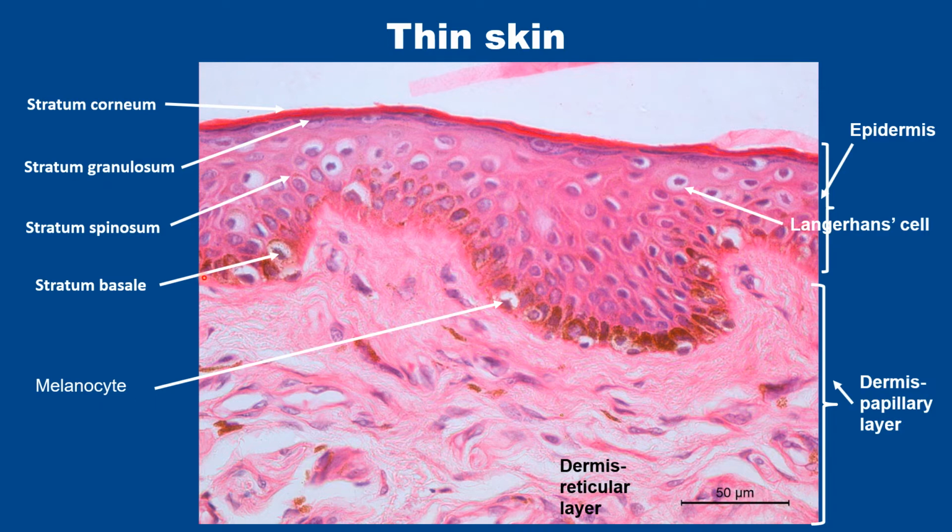Now stratum basal, there are lots of cells with pigments. Here the melanocytes can be seen. There is a cell here with some spaces around it. Here also another one. There is another one. This is another one. One can see some of the dendritic processes also coming out, and the other cells which are visible are the stratum basal cells, or the keratinocytes. They have engulfed the melanosomes, or the tips of the dendrites of the melanocytes. So this is skin from a dark colored person.